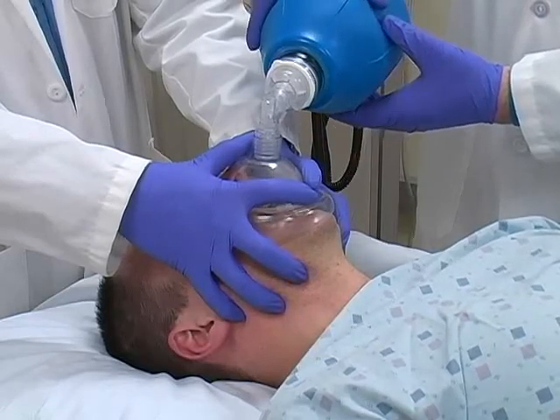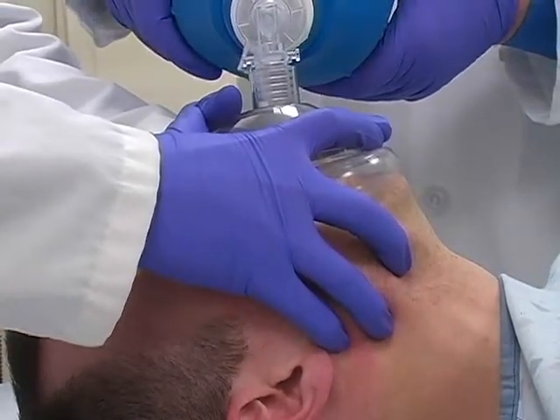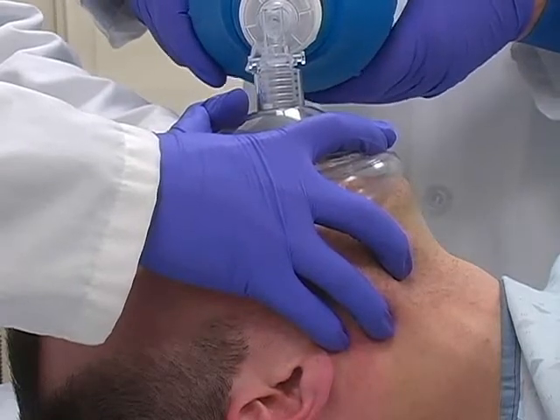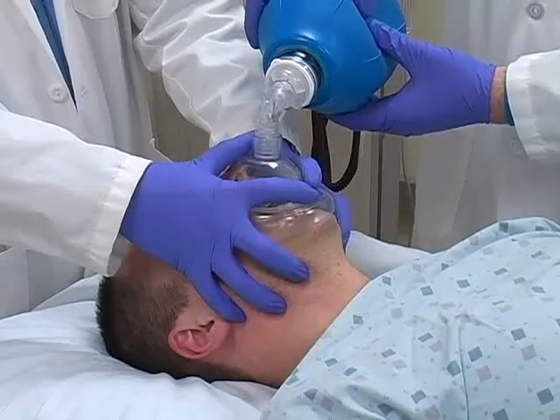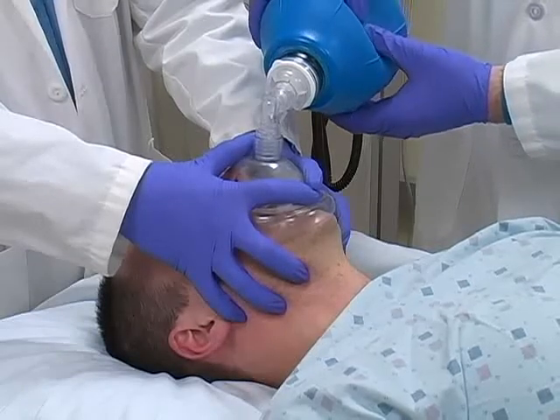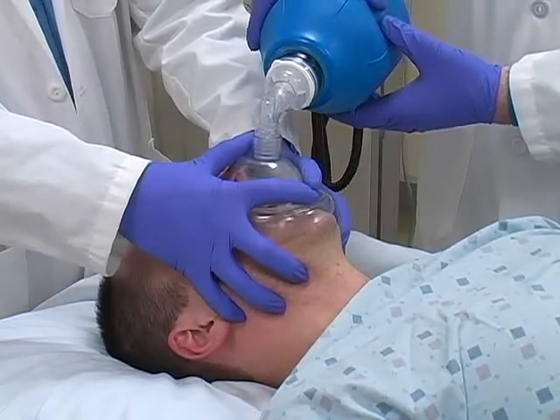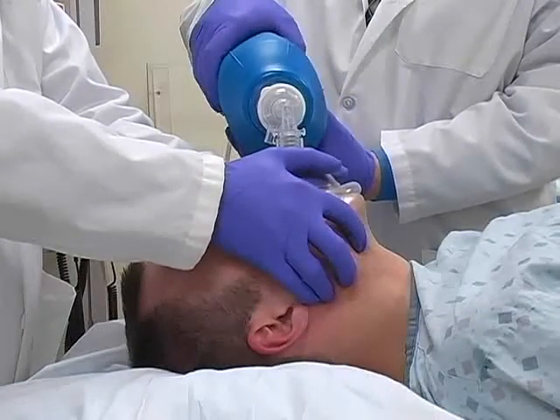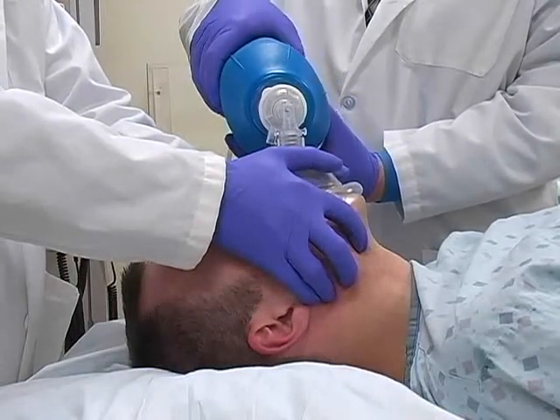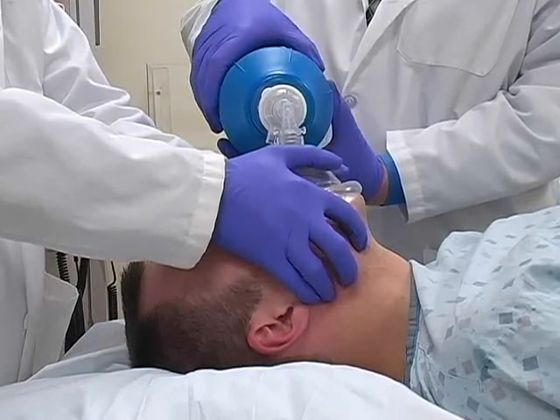Note that the first clinician may provide a head tilt and a jaw thrust maneuver while holding the mask onto the patient's face. Observe for proper chest rise during ventilations. An alternative method, using the stronger thenar eminences to hold the mask to the face, may be used if desired.